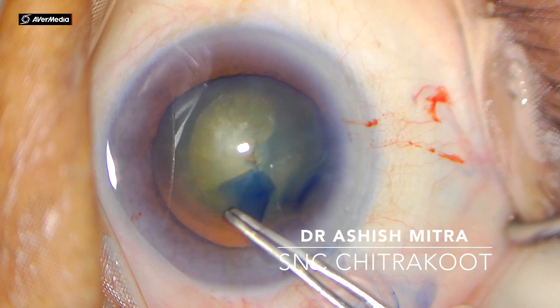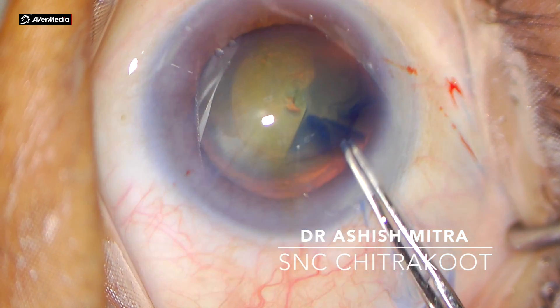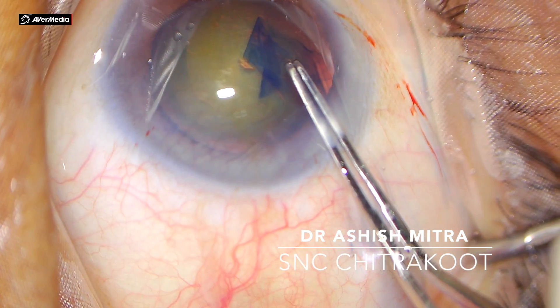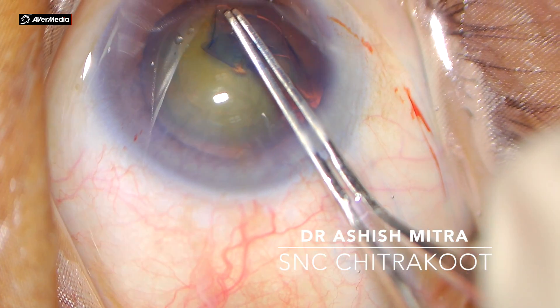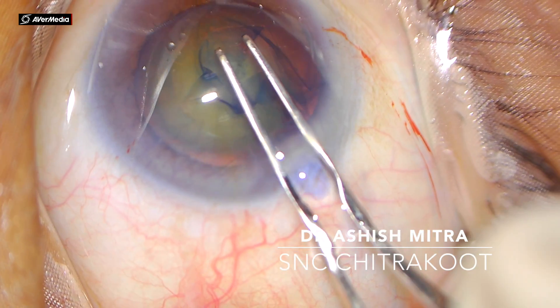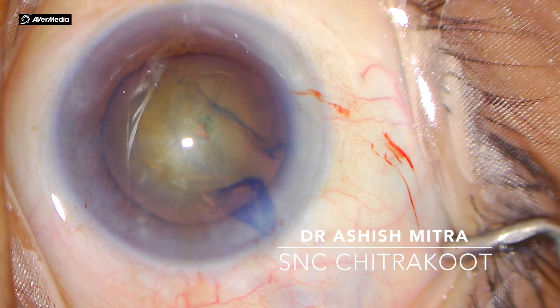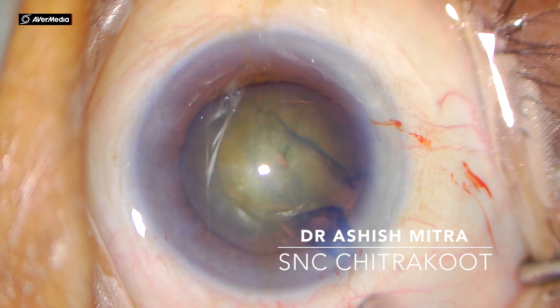Now the second quadrant — I am moving, and now I need to change my direction again so I would be moving slightly towards the center so that my rhexis changes direction. Now I am making the last quadrant, and when you hold the flap from the base, pull it towards the center. See, the rhexis is completed now.